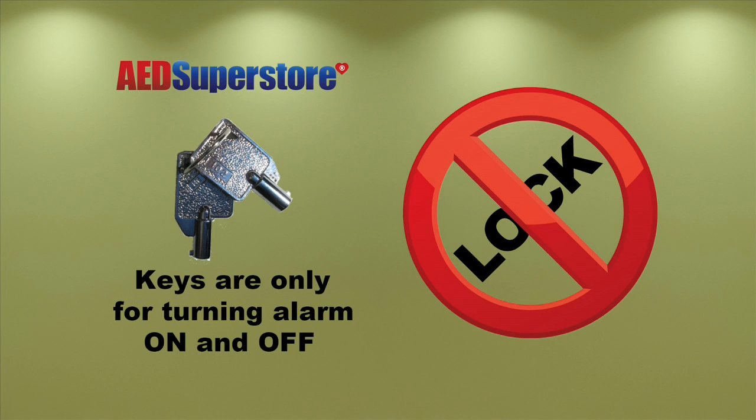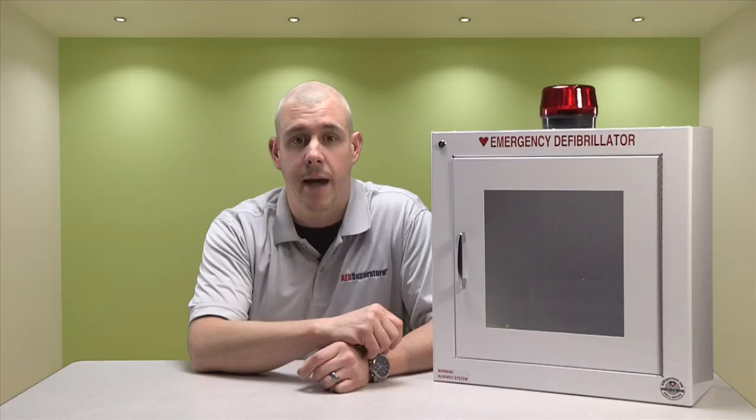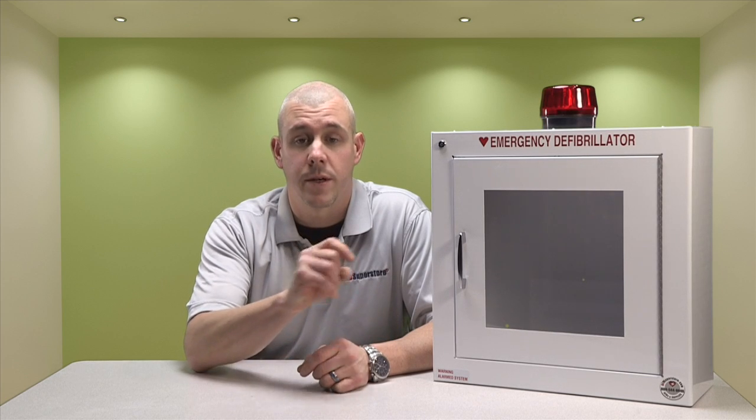Other questions we hear pertain to the cabinet keys. What are the keys used for, and will the cabinet lock? The keys you get with your cabinet only serve to arm and disarm the alarm. Our keys do not lock the cabinet because it is our opinion that a locked AED cabinet could be a liability that outweighs the risk of theft.